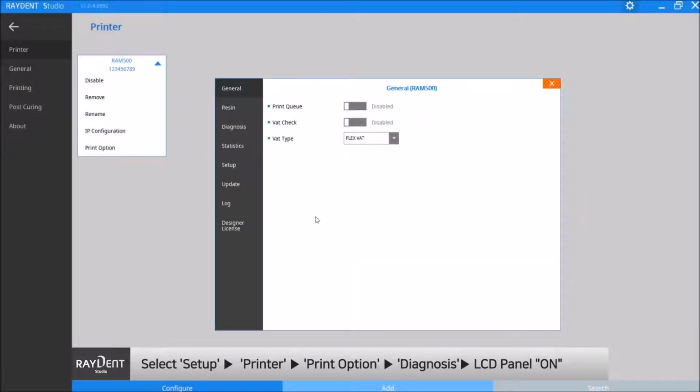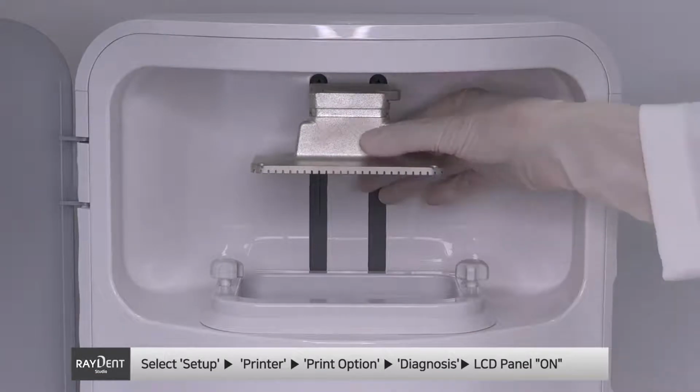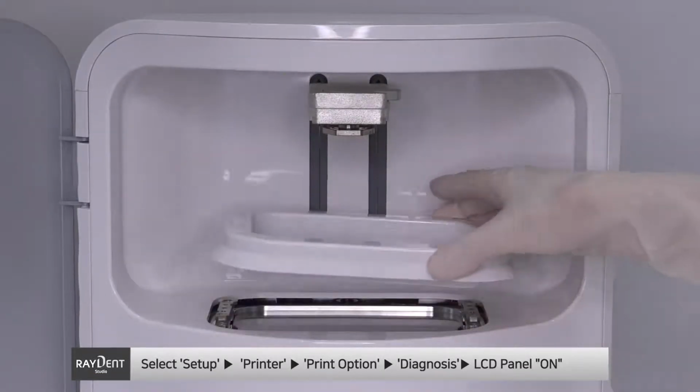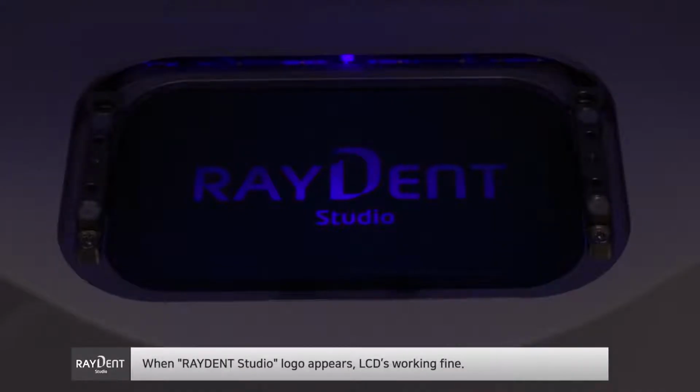And if you look at the menu on the left, there is diagnosis. Click and you will see the LCD panel at the top. Remove the build plate and VAT out of the chamber, and then click on and visually check whether the RAYDENT logo is projected or not inside the chamber.